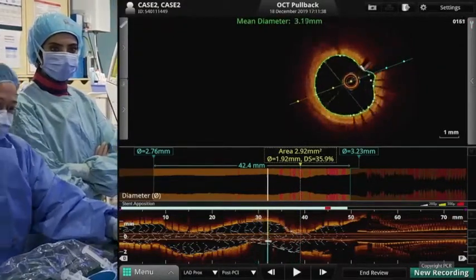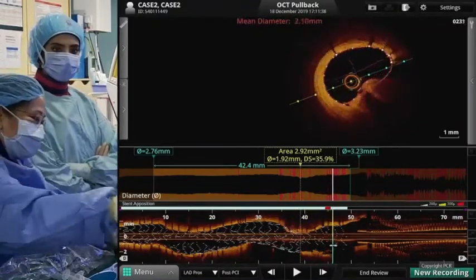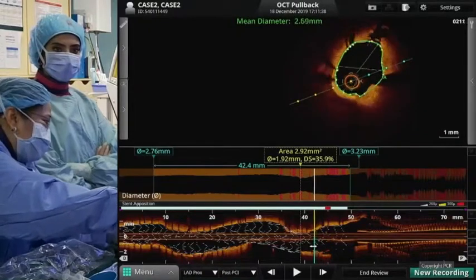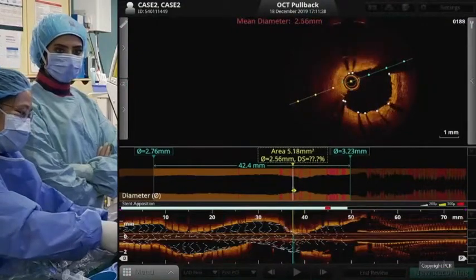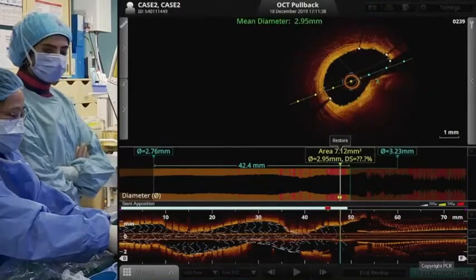So you have to really check that the machine is really tracking. Did you see that? The point where it's telling you that it's 3 millimeters squared is actually more than that, so you have to have a look at that. There, for example, you see the contour was wrong. So it's important to double check. Don't trust the system by default.